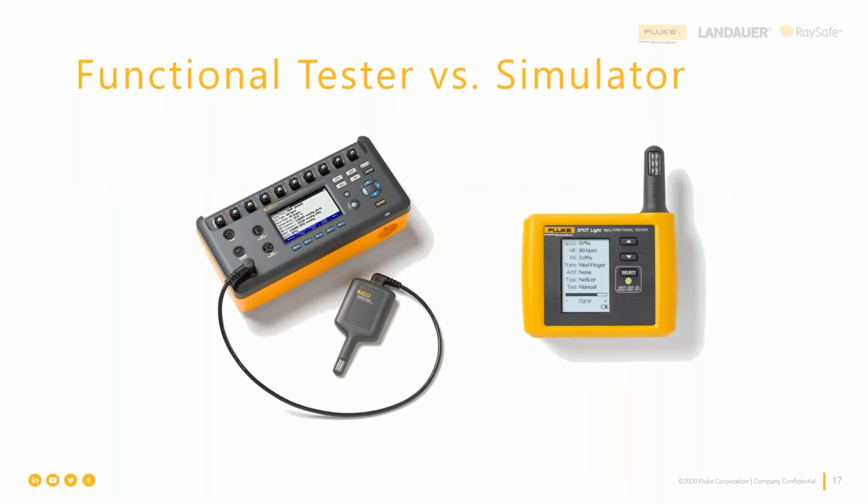Jerry, take it away. Well, according to the US FDA, Food and Drug Administration, who regulates even us as a manufacturer of test instruments, there is no true simulation of the human physiology when it comes to pulse oximetry. Well, why do they say that?